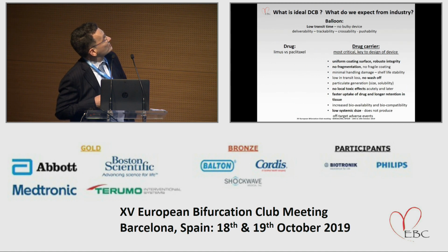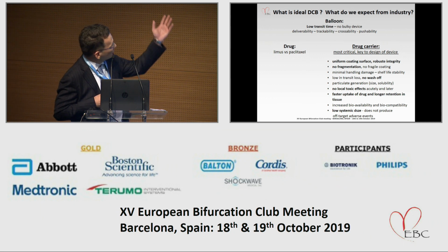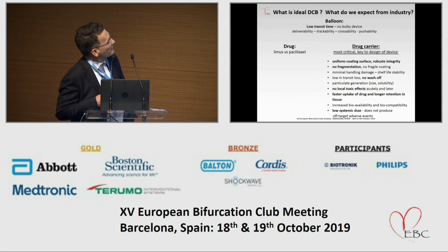What constitutes an ideal balloon? A low transit time, a deliverable, trackable, crossable balloon, a drug of our choice, I'm going to come back to that, and a drug carrier, which is the most critical key to the design of the device, featuring all these elements.